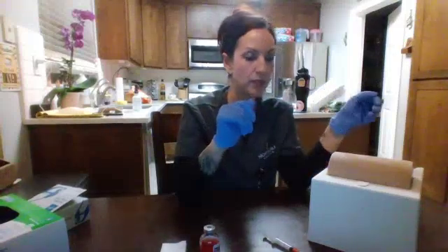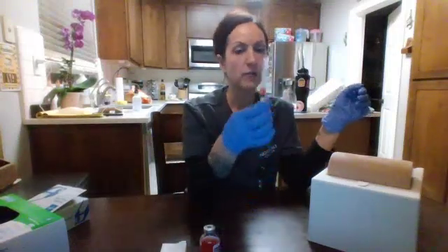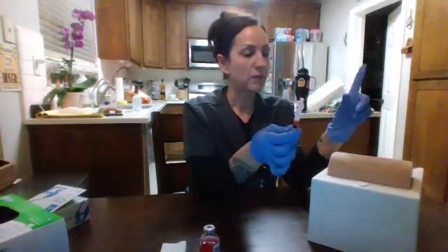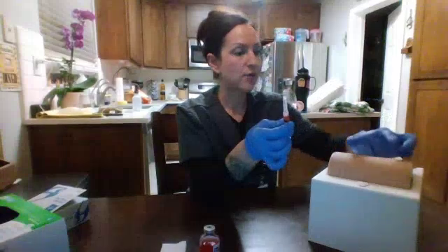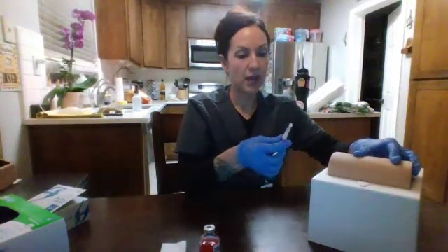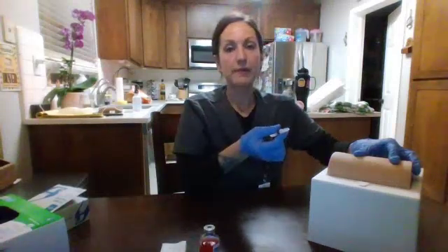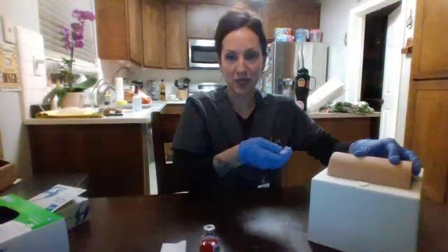Now, once I'm ready to administer the medication, I'm going to pick up the syringe in my dominant hand with my thumb and my forefinger. With my thumb and forefinger of my non-dominant hand, I'm going to grasp the skin and pinch. Because I'm administering heparin, I will be pinching the entire time. If I was not administering heparin medication, then I wouldn't be pinching the entire time.